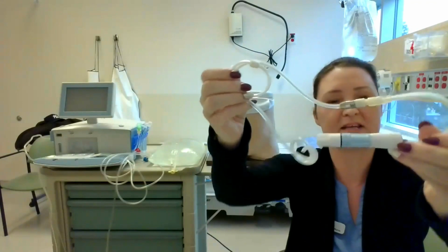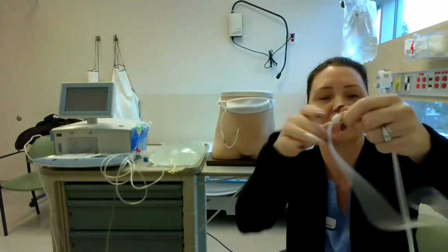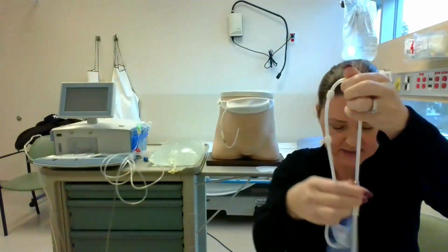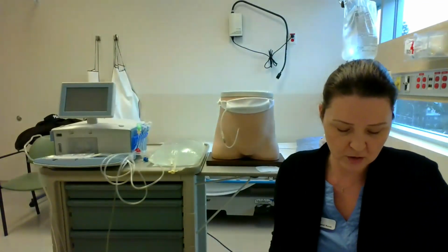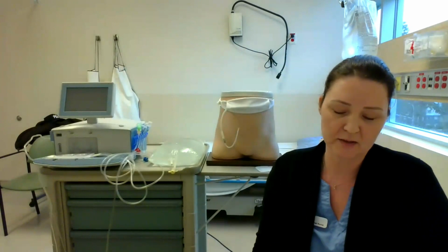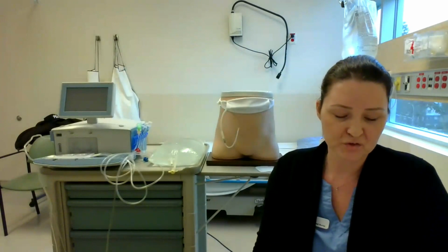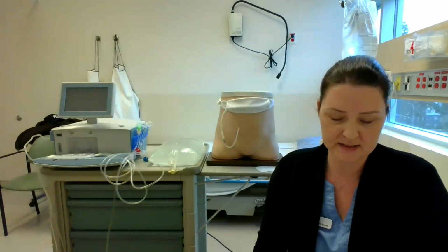This is placed in the lower abdomen area. The Dacron cuffs, if you can see, are what holds the PD catheter in place. It's inserted in the OR, radiography, or at the bedside. The nephrologist will decide when one is appropriate for you. Insertion is considered when the GFR is around 15 or less.